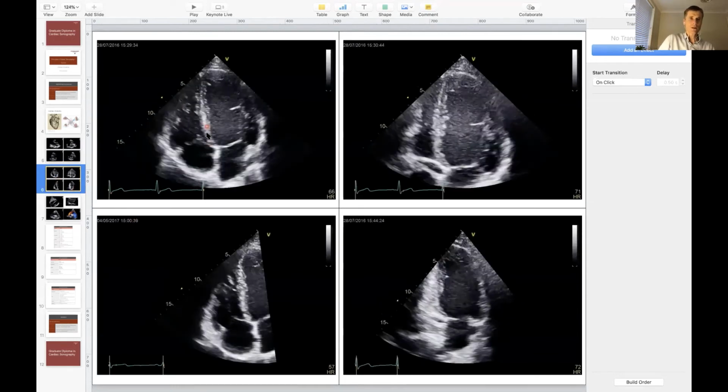Here we see the left ventricle again. We see the septum, the apex, the lateral wall. This one's focused up here, and what I hope to help you to appreciate in this particular one, as was highlighted in the lecture on anatomy, is that there are basal, mid, and apical portions. So it's helpful to divide the left ventricle up, oftentimes, because those regions correspond to different territories that are supplied by coronary arteries.